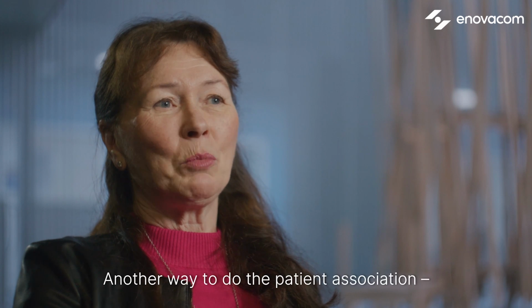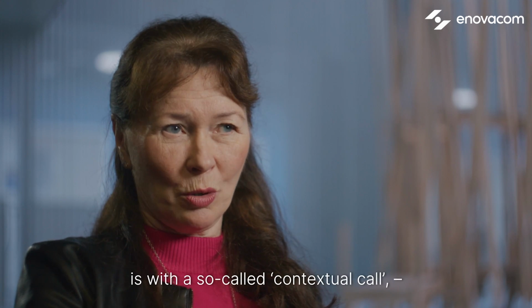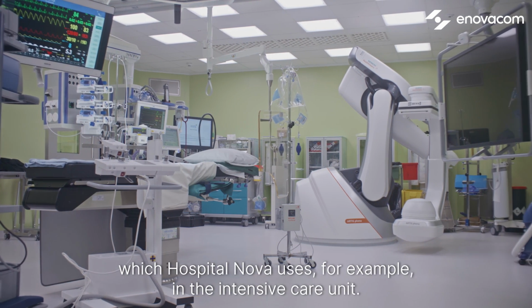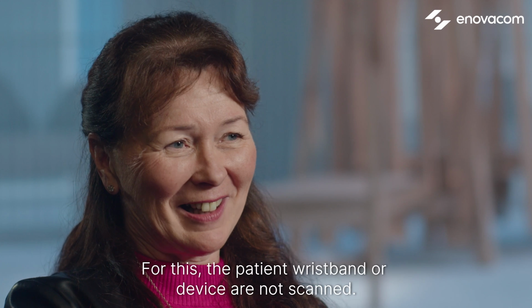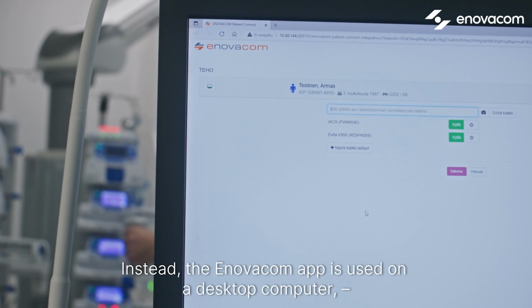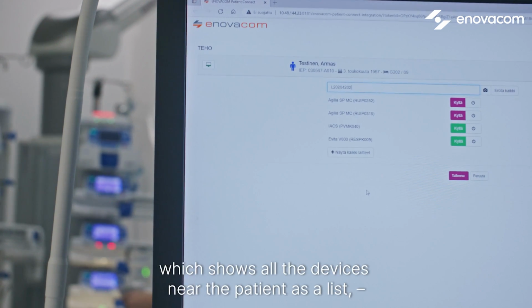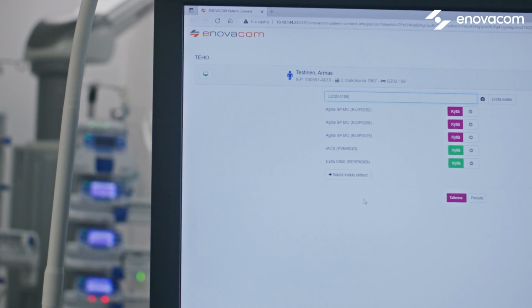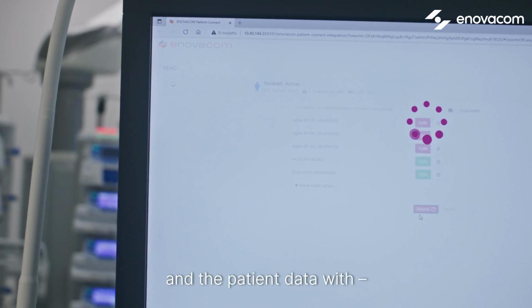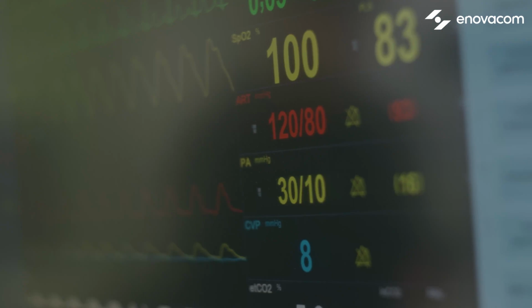Another way to do the patient association is with a so-called contextual call, which Hospital Nova uses, for example, in the intensive care unit. For this, the patient wristband or device are not scanned. Instead, the Enovacom app is used on a desktop computer, which shows all the devices near the patient as a list. And Enovacom's system associates the devices and the patient data with the patient record via one path.